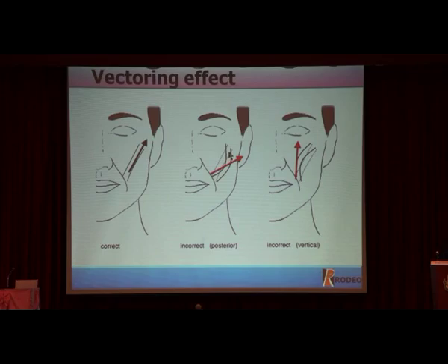Horizontal lifting makes a flat convexity of the malar area. In large patients and small patients, inserting in an incorrect direction makes the face look large. In patients with a large face and large zygomatic area, vertical vector thread insertion makes volume augmentation.